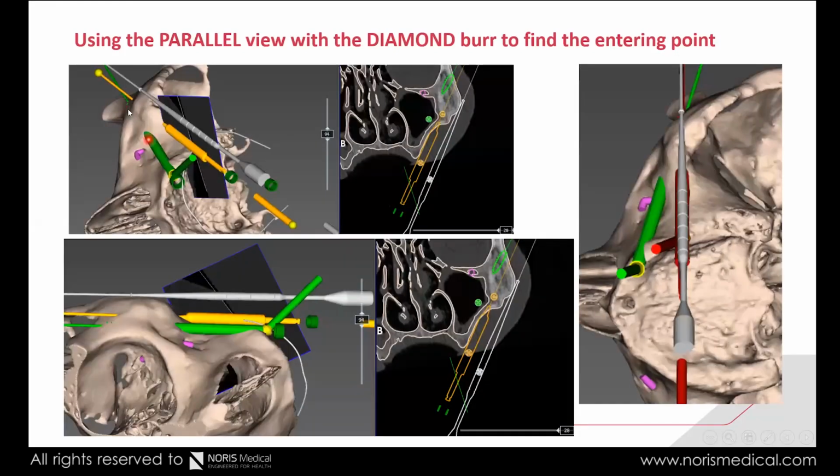First of all, we have already the anterior implant positioned, and as I said, we want to have it positioned as close as we can to the orbit to give us the most amount of bone here for this playground we're at. And we guess a point here. We just guess a point. We make a hole, a small drill, and we put the tip of the diamond in this drill. And we start going down. When we go down, we see the distance between the diamond tool and the drill. And we look from the other direction from here, we see we have no distance.